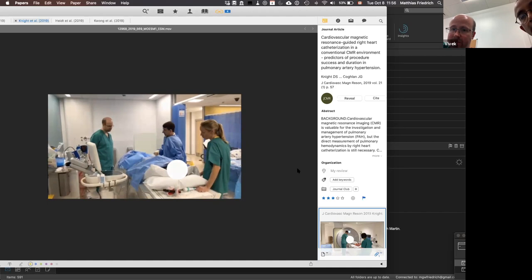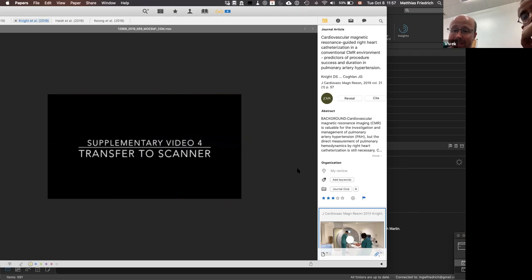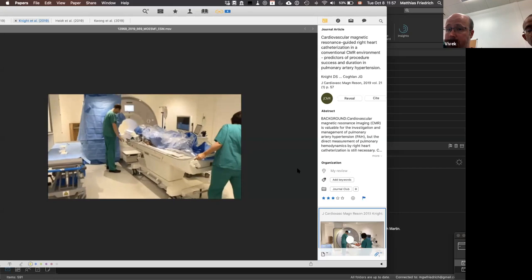No metal goes in the scanner. This bit is actually quite important. It seems trivial, but it isn't. So the operator side is wrapped first, and then the other side is brought over, and that means make sure you have a sterile field. And then we transfer the patient back to the scanner. Whilst Jerry Coughlin, who's the catheter operator there, has been putting the sheath in, we've draped the scanner with two drapes, just a standard femoral angioplasty drape, and also a smaller drape going inside the bore, so that because we're working from that side, we don't de-sterilize while doing it. And so that's the setup.